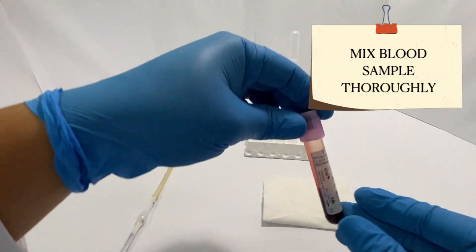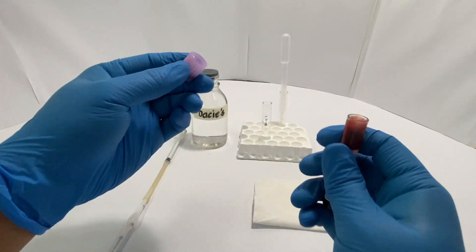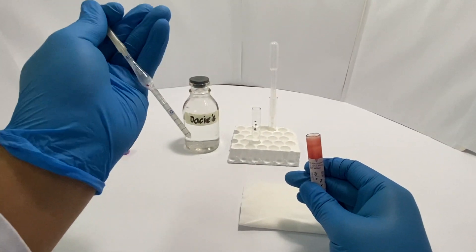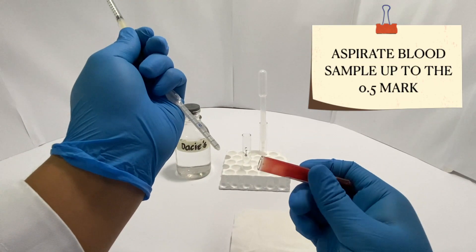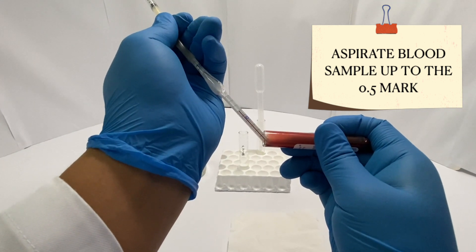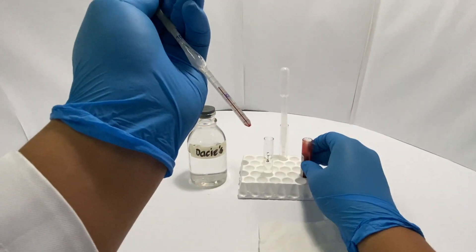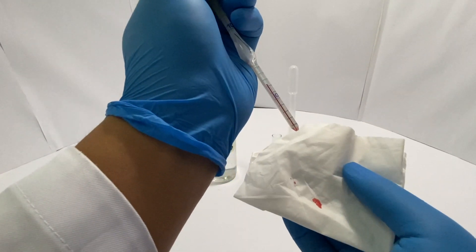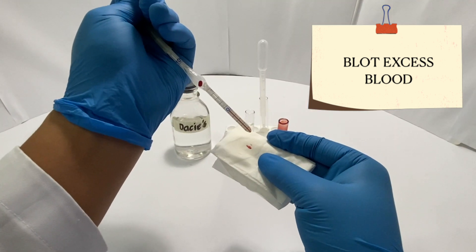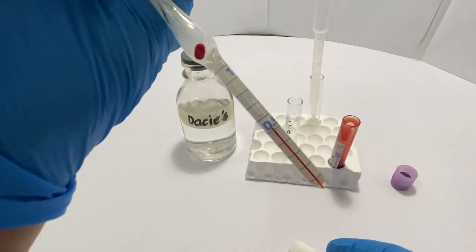Once you have done that, take your blood sample and invert it a few times to mix the blood thoroughly. To collect blood, first take your pipette and pinch the rubber tubing a bit to create a small vacuum. Now tilt your tube slightly and place the pipette tip on the opening of the tube. Aspirate by releasing the tube slightly and make sure you do not go past the 0.5 mark. If you do, you can remove excess blood by either blotting it on a tissue paper or gauze. Once you've done that, make sure that the blood level is again at 0.5 on your pipette.